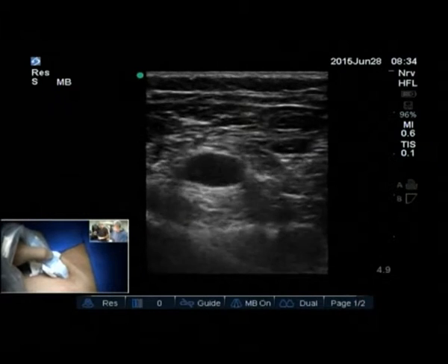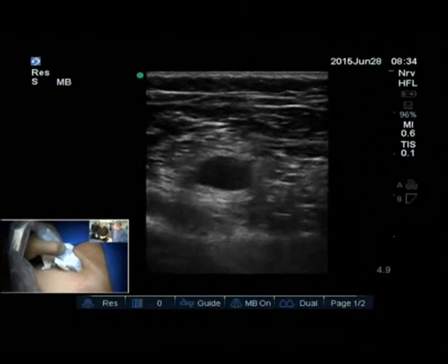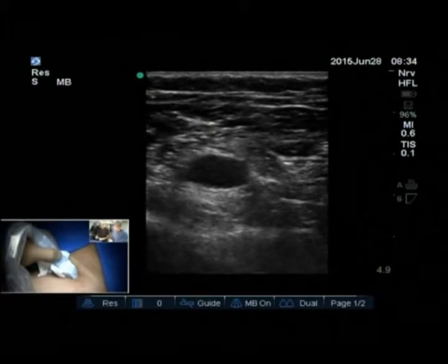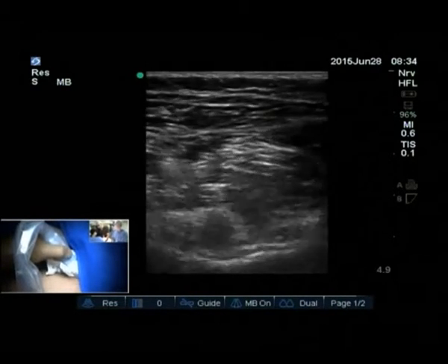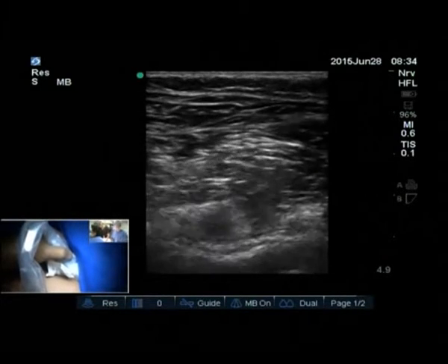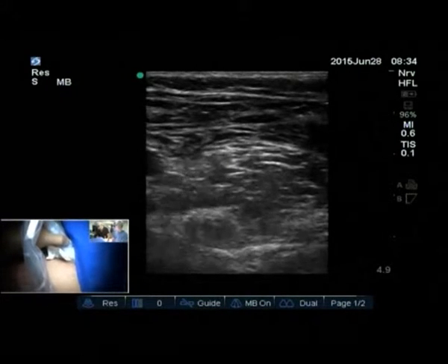Now what you don't want to get fooled by is a very bright structure underneath the artery. That is acoustic enhancement artifact. So that is not a nerve. And you can see it in the infraclavicular area as well. So don't get fooled. The muscular structure that you should look for is the iliopsoas muscle. I'm looking at the muscle right there, a big muscle bulk. You know that the nerve cannot be inside the muscle bulk. It has to lie on top of the muscle.